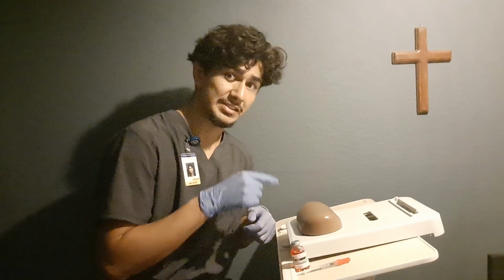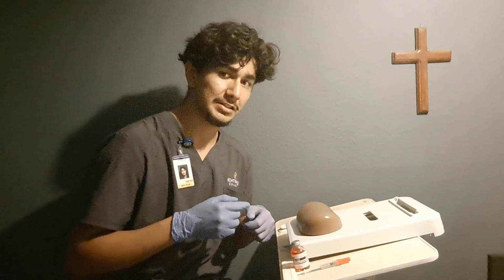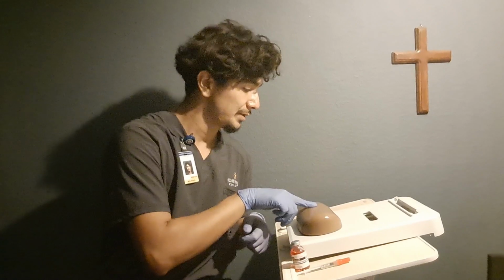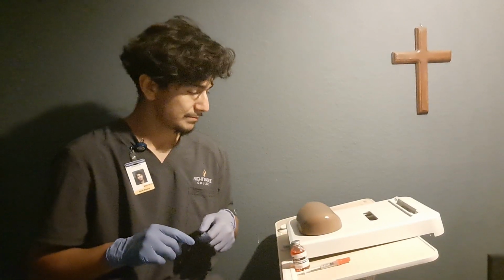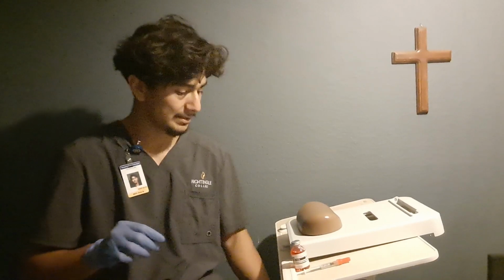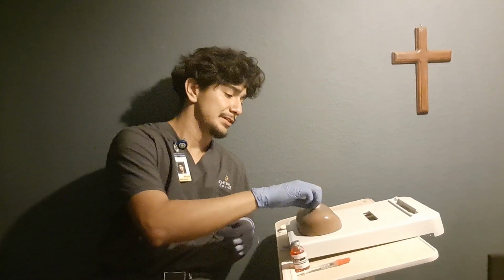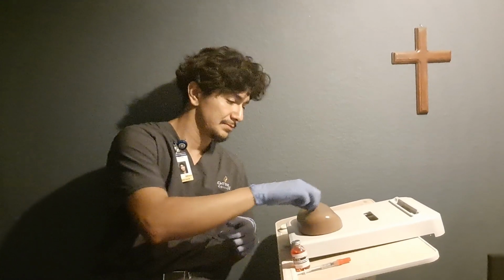so the first thing we're going to do is assess the patient's forearm, if there are any lesions, discoloration, or if you're going to palpate the skin for any tenderness. Do you feel any pain or tenderness there? No? Okay, great. Okay, now that that's been assessed, we're going to go ahead and get the alcohol prep pad, a new clean alcohol prep pad. Start from the center and work our way out approximately 2 inches.